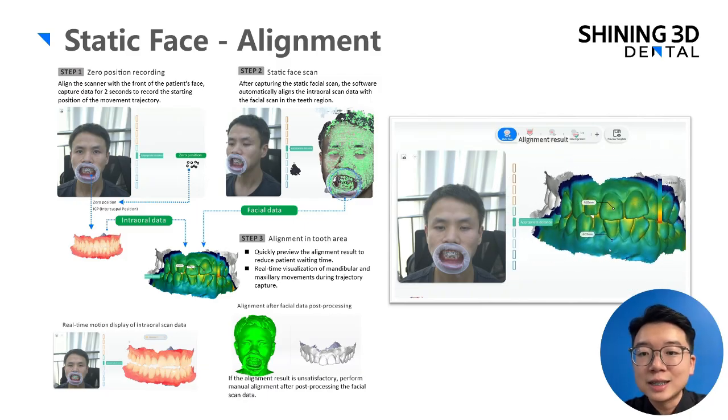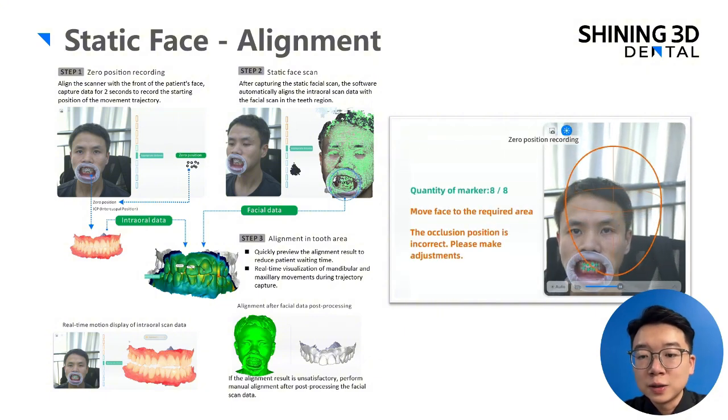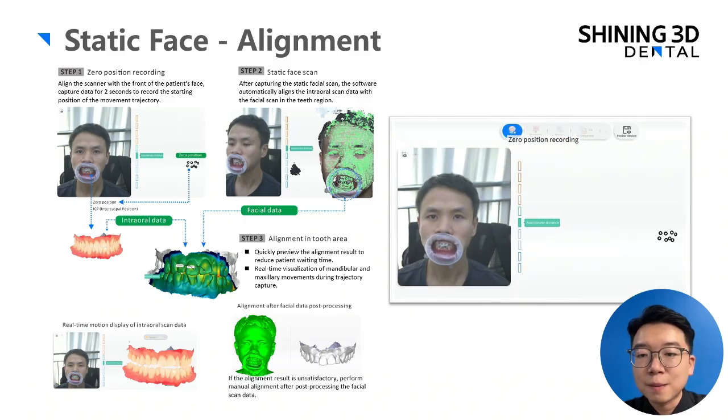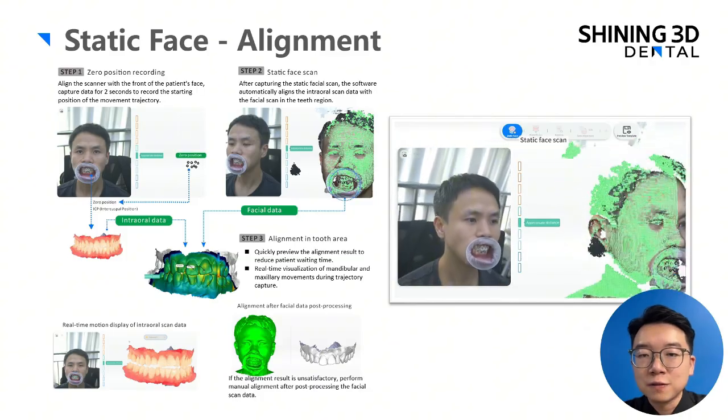It's included inside the one single scan. Just the first 2 seconds, make sure you keep stable at the zero position to let the scanner capture the marker position first, and then we can start our face scan.